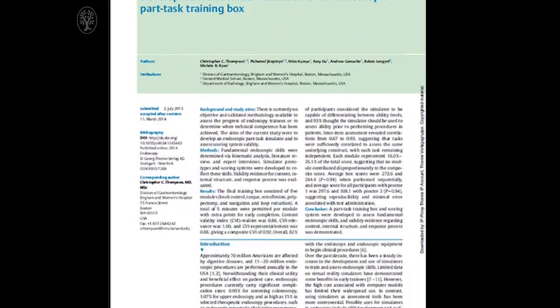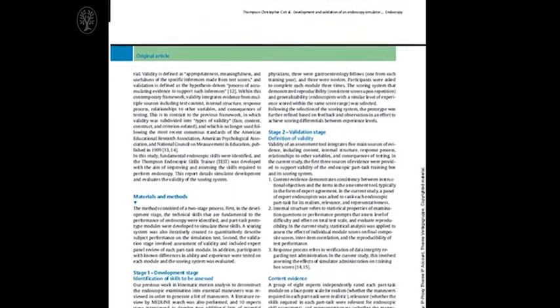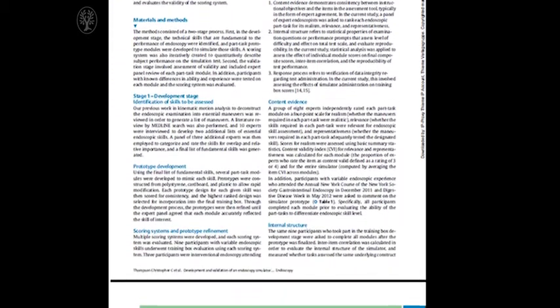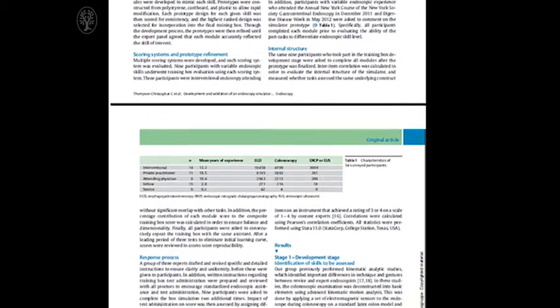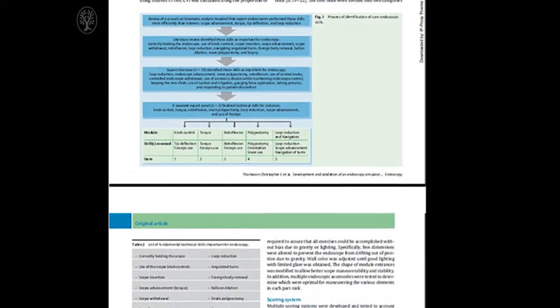First, we did kinematic analysis to break down the core skills. And how we did this was that we fitted master endoscopists and novice endoscopists with electromagnetic sensors so that we could record all of their movements during endoscopic procedures. We then analyzed the data and looked for the biggest discrepancies. And this was very helpful in determining certain maneuvers that experts did very well, but novices did not do well at all. And those ended up becoming some of the fundamental skills in our box.